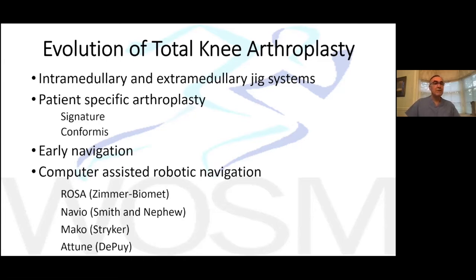This is a significant problem, which I think has led to the limited usefulness of this device, and is probably the predominant reason why it has not really taken off and has only a very, very small part of the total knee replacement market. That is, you get one implant, it comes in a box with a tool set, and if there's any need for any type of modularity, which happens all the time, if not every day in the operating room, then that implant may or may not be the ideal fit for that patient, or might not have the exact right parts for that patient.